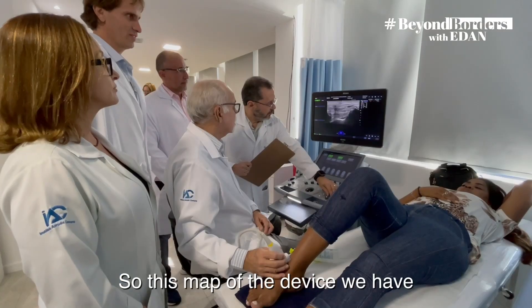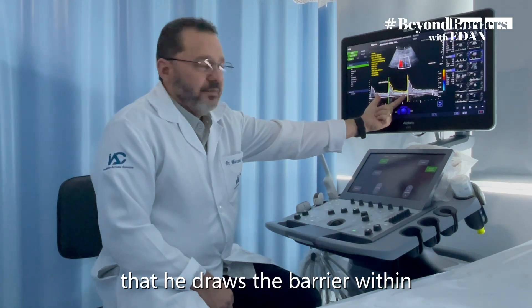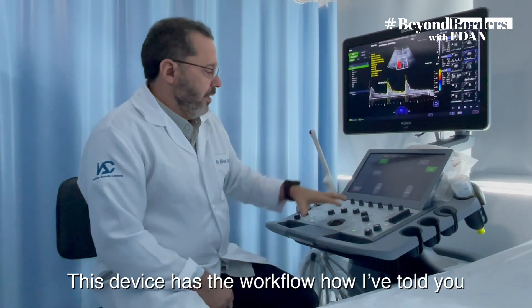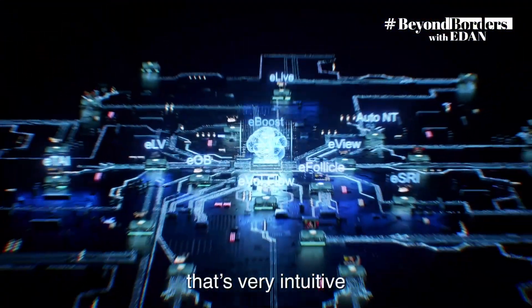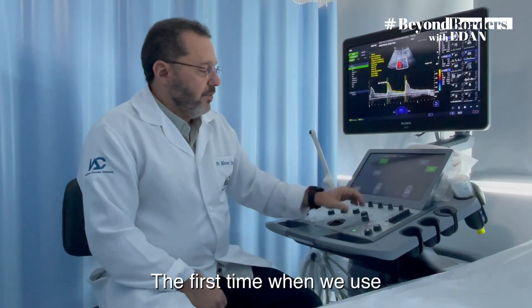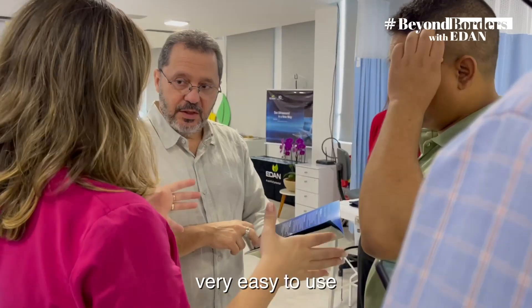So this map — the device we have — the automatic trace draws the barrier within. The device has a workflow, as I have told you. The first time when we use it, we can make all the choices with ease. This is very easy to use.